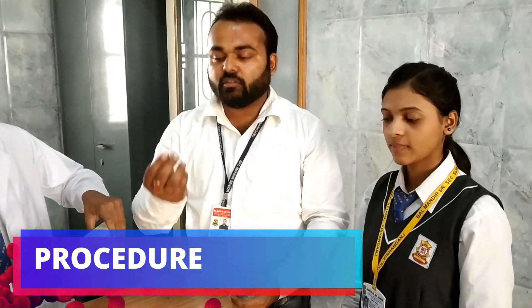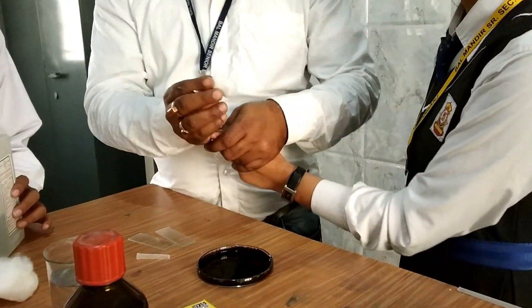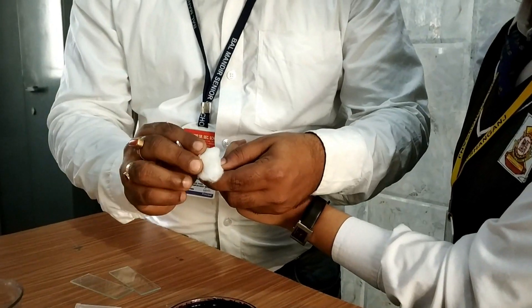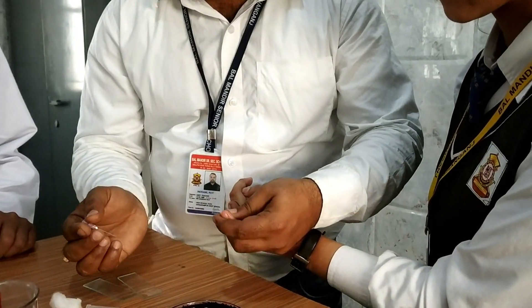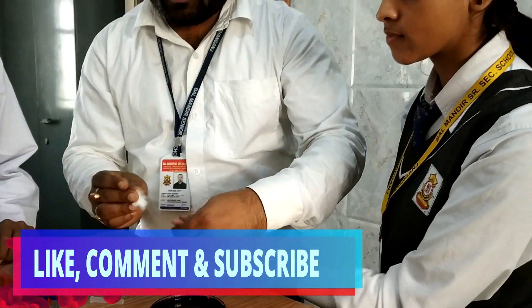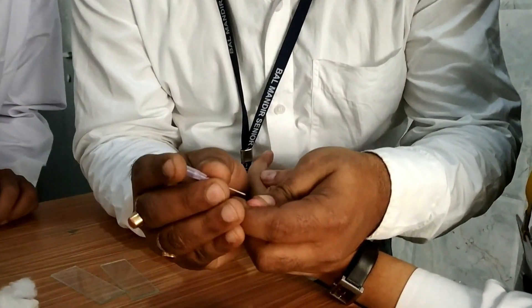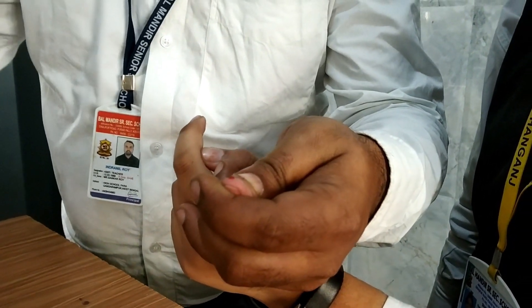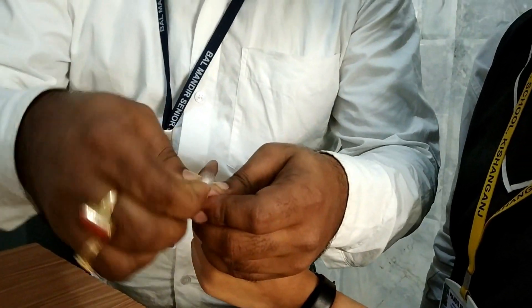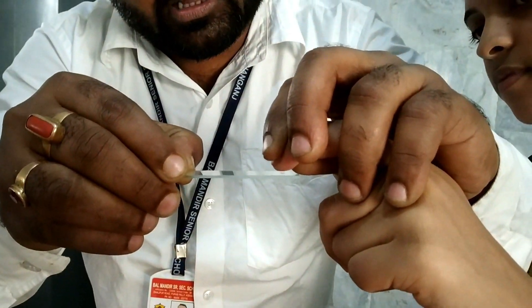First of all we need to take one needle and a little cotton with alcohol. We need to prick the finger, but before pricking we will use a little alcohol to make it sterilized, and when it becomes dry we will prick the finger. Here you can see the first blood coming from the finger — we will discard it because there is a chance of mixing with the alcohol. So we will take the second drop of blood and keep that blood droplet on the slide.